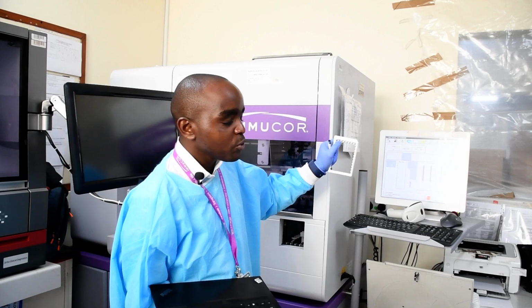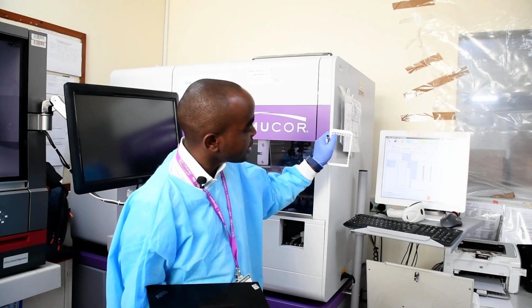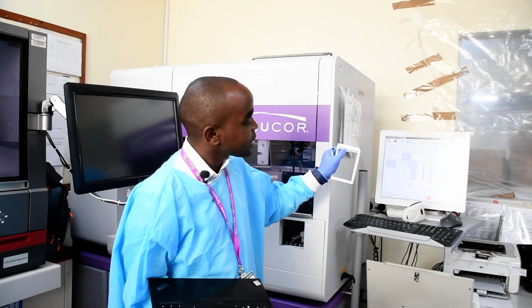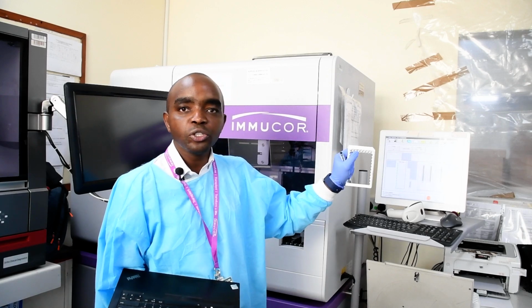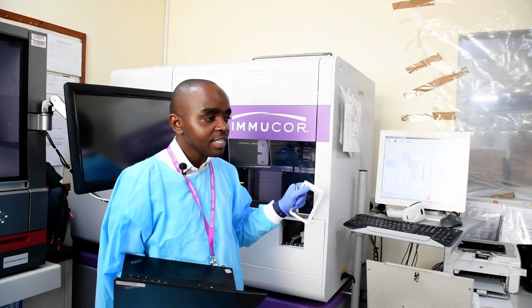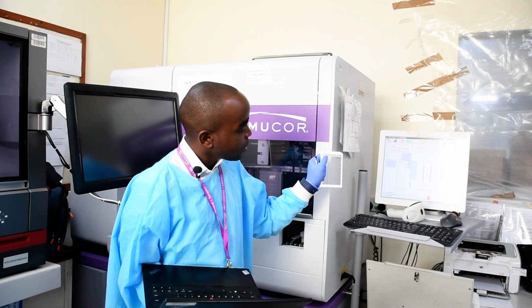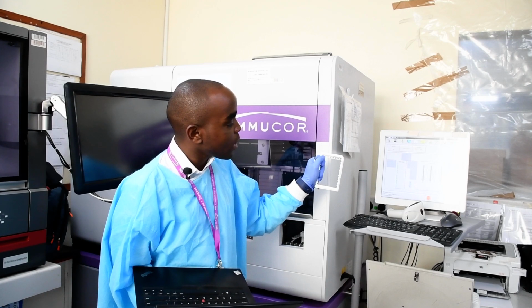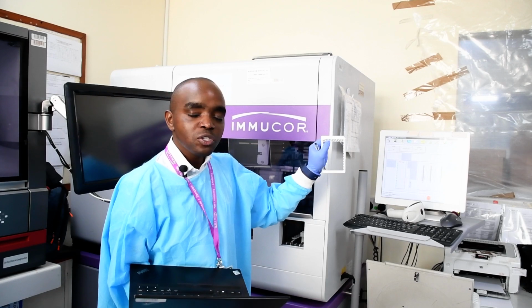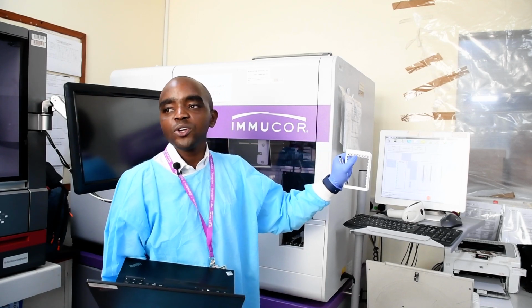So what we are calling the titer here: you can have a reaction at the second well, but for you to report the titration, it is the last one that will give a +1, the grading that we know. So it could be 64, for example, or 1:2 here is giving a reaction, and 1:4 is also giving a reaction, and 1:8 is also giving you a reaction.